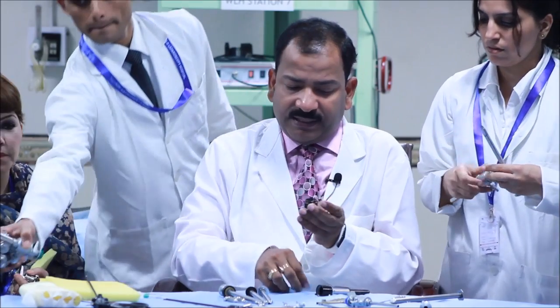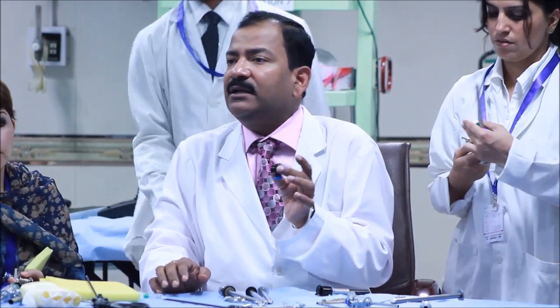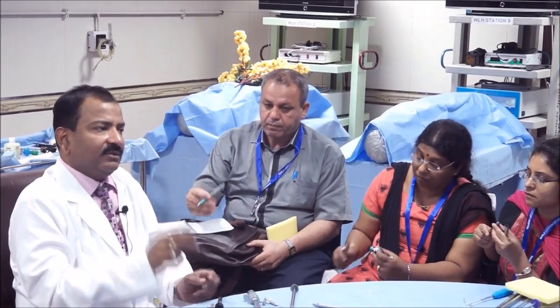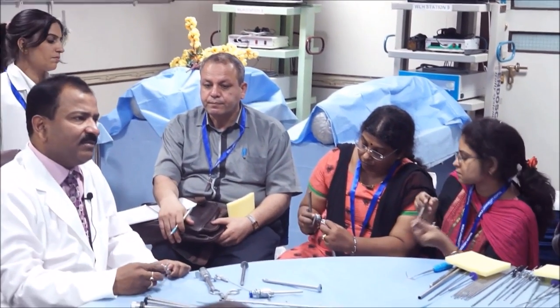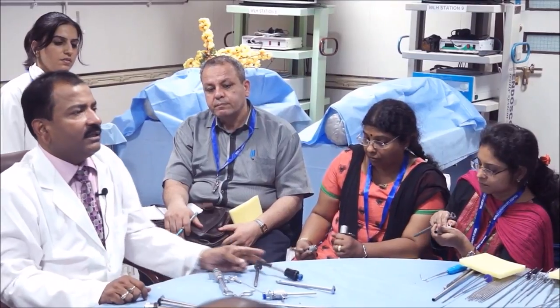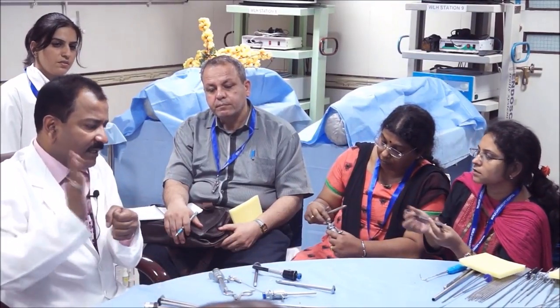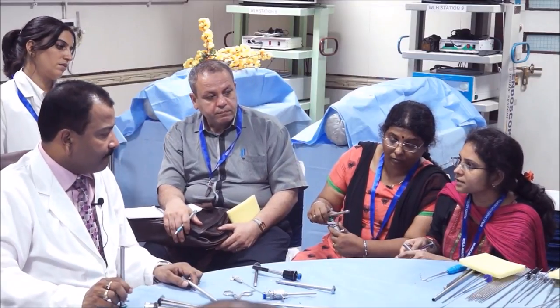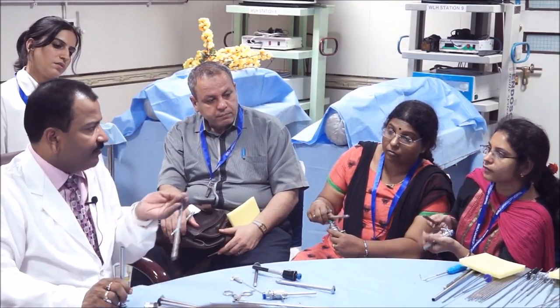Magnetic valves are also present, also useful. But the only problem is, sometimes during cleaning, your nurse can miss the magnet, and the magnetic force is not very strong. So, sometimes blood clots or fat get deposited in between the magnet and the seal and then gas keeps on leaking. So, it is less popular. People are not using it much. Maximum number of the companies, even the stores and all, make the flap valve, which is opening and closing. Now, yes, this is communicated with the back.